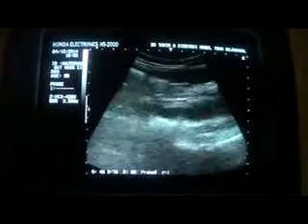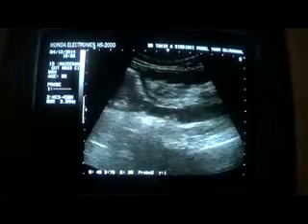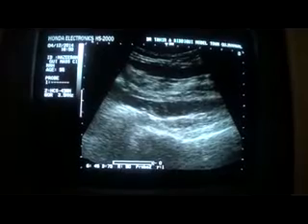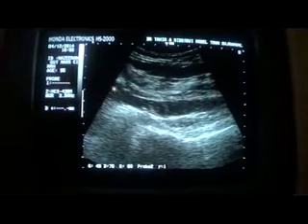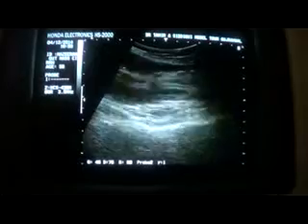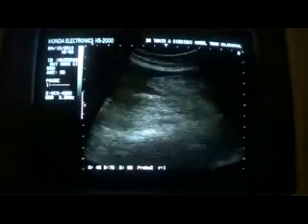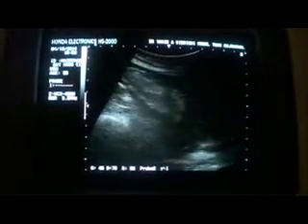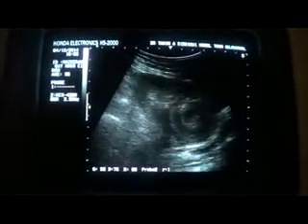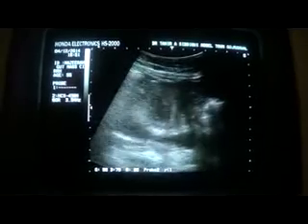but this segment, this one, now it's seen extending from the left upper abdominal quadrant, and I can follow it down not only up to the left lower abdominal quadrant, rather above the urinary bladder.